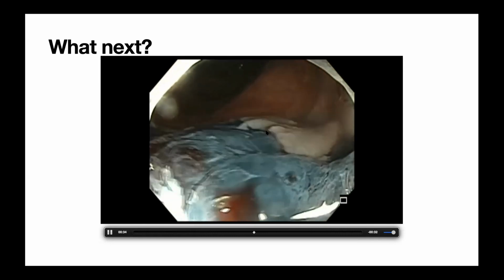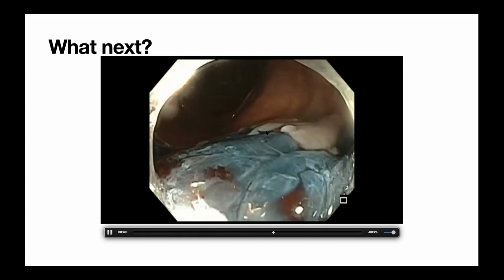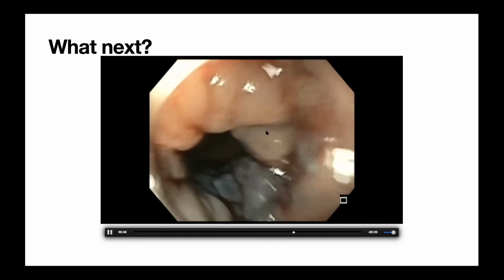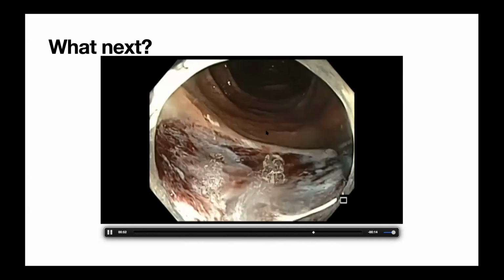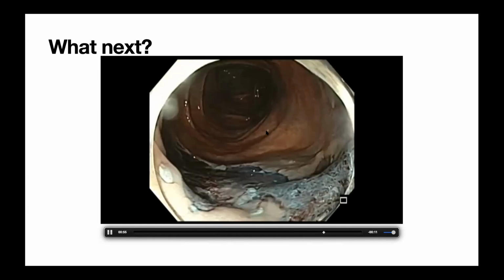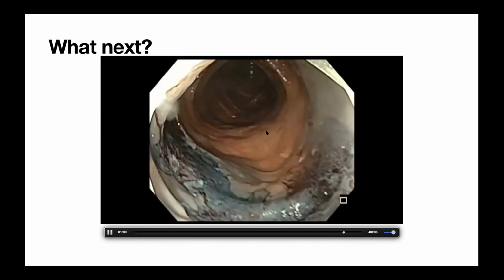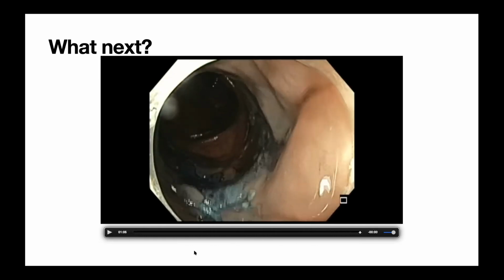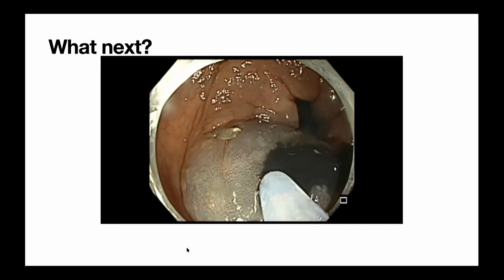And we realized that on the northwest corner of the resection, we left almost a 2 centimeter area that we did not resect completely. And I'm glad that we did that. Otherwise, the risk of polyp recurrence would be very high. So we went back and defined that area and then resected it. And then we put a tattoo here. And then we pull the pieces.